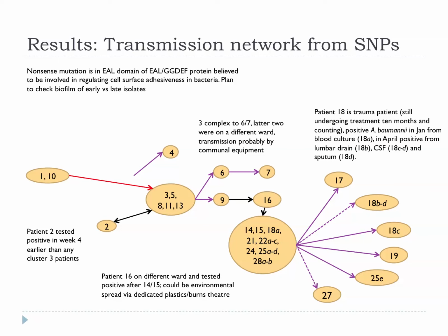So you've only found patients that have had SNP variations where a mutation occurred in the same strain, haven't found an infection with another strain that was around in the hospital at the same time? Not from these, not in this study so far. That is obviously something that can be done as well. And again, people in Oxford just published a paper where they showed that a Clostridium difficile outbreak, supposedly, suddenly, 3 patients all with C. diff on the same ward at the same time. They genome sequenced them and found they were totally unrelated. So again, it is entirely feasible to do that.